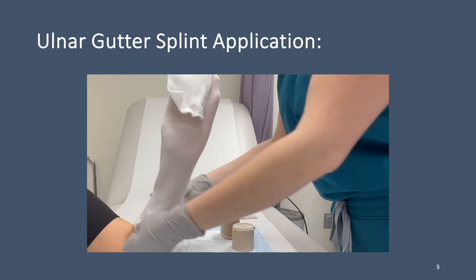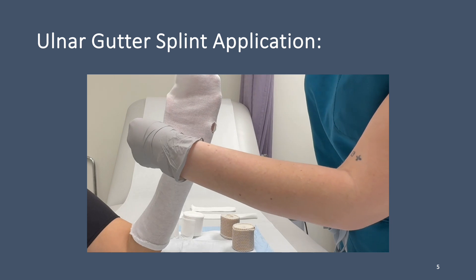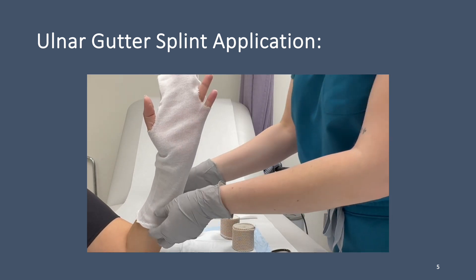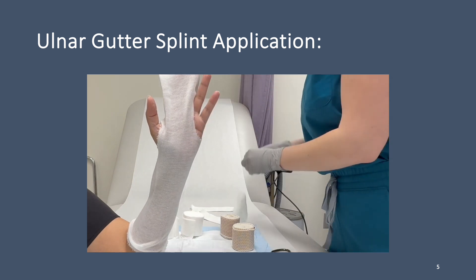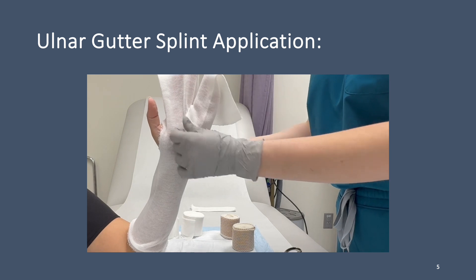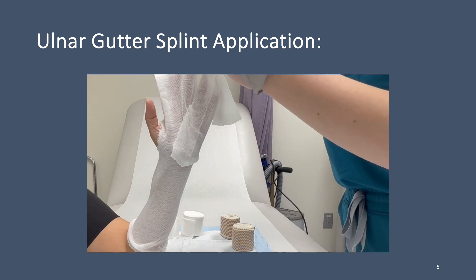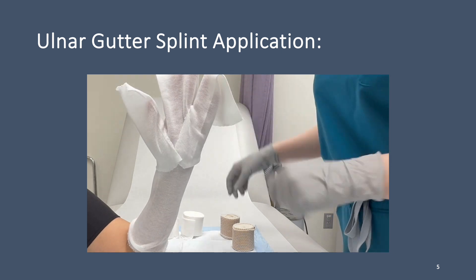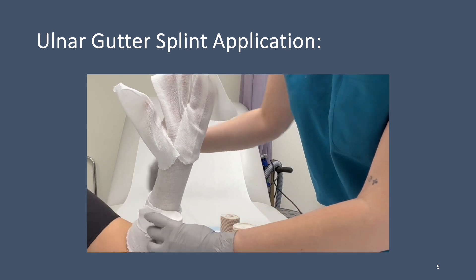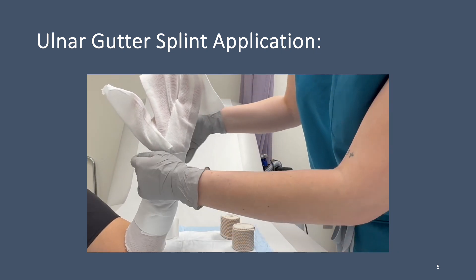Place the patient in the appropriate position for an ulnar gutter splint application. Apply the stockinette over the injured area and cut to size. Place the soft roll over the extremity, making sure you have a 50% overlap while applying the soft roll.